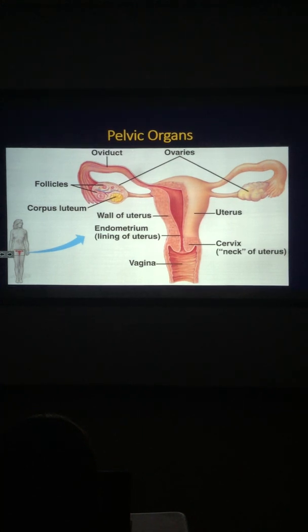But nowadays, you know what people do? They inject contrast into the cervix. Contrast means air, normal air. They inject normal air and see in ultrasound whether air is going through the tube or not. As such, the tube can be seen very beautifully. You can diagnose any block in the fallopian tube by putting air into the system. Air is very safe and doesn't cause any harm to the patient. This is one of the best tests nowadays for visualization of the fallopian tube.